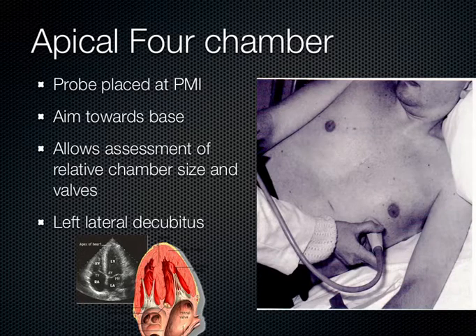Now patients who have chronic obstructive pulmonary disease or who smoke a lot lose that PMI, it goes away, because their lungs expand to fill that little space. So this is a very difficult window to obtain in patients who smoke or have chronic obstructive pulmonary disease, or COPD. But this next week with your models, you'll see none of them do that. They all have really good PMIs, so this is a pretty easy window to get, hopefully, next week.